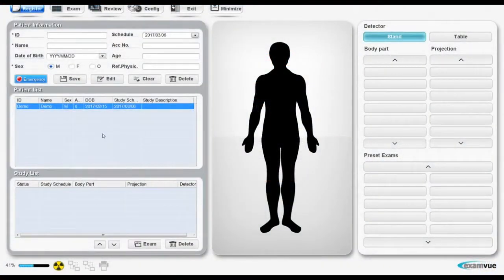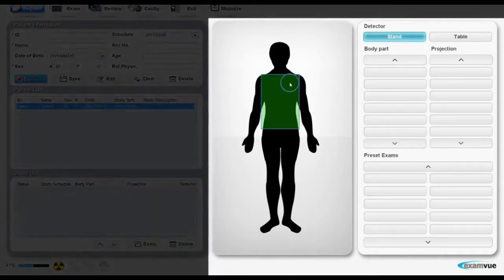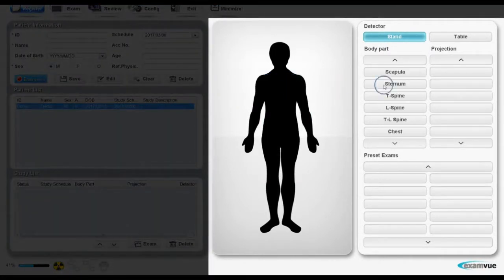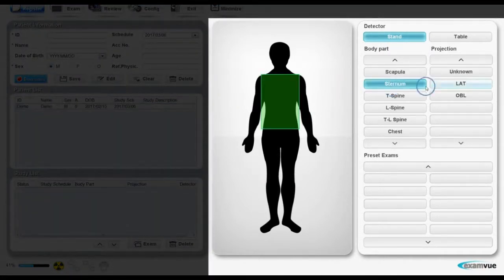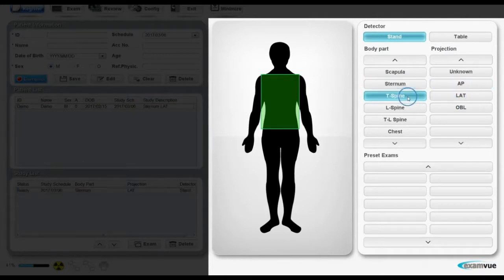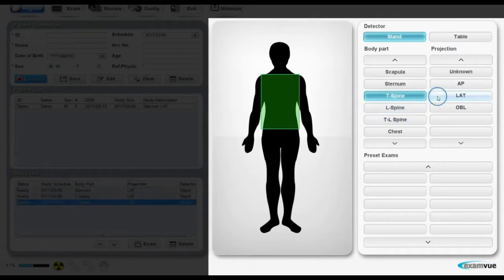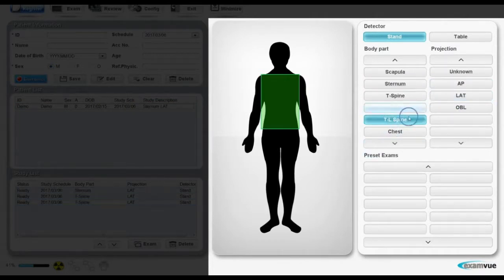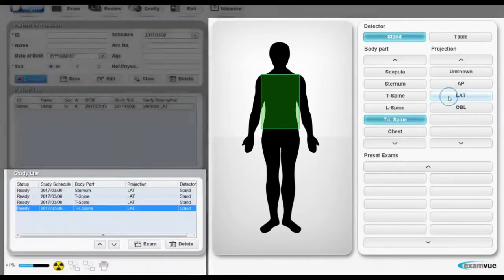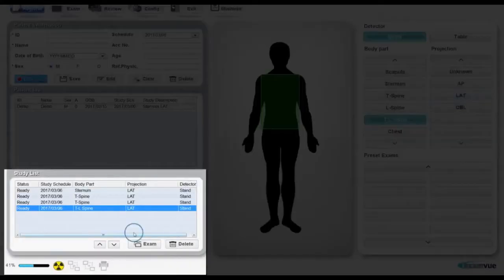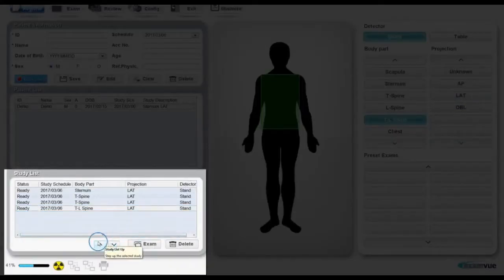Study Setup. To create the study, first select the body part and the view that you're planning to do. You can do it one by one with any number of x-rays you're planning to take. You can move them or arrange them accordingly to the order you want to take them.